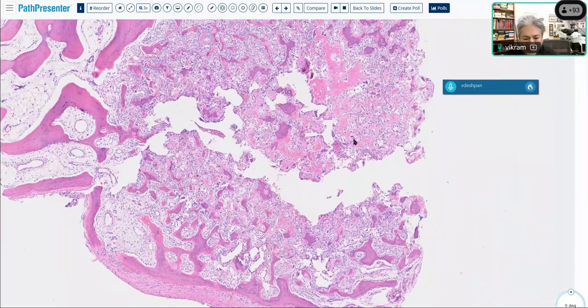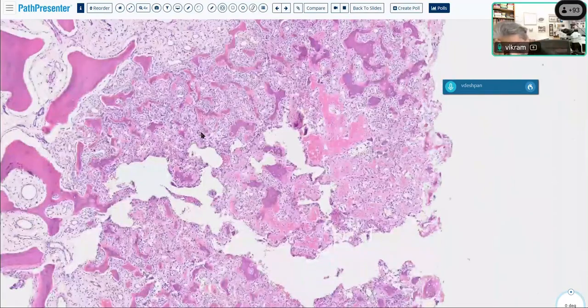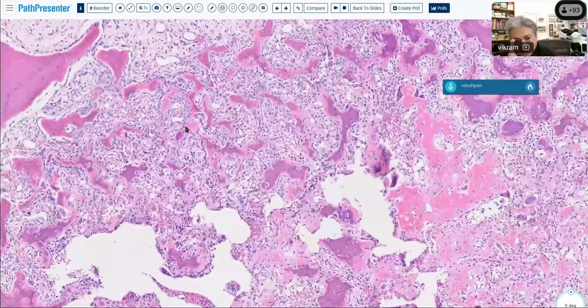That chicken wire, it's an interesting one. I don't remember chickens in India, but chickens, no, I'm just kidding. This is too fat to be chicken wire.